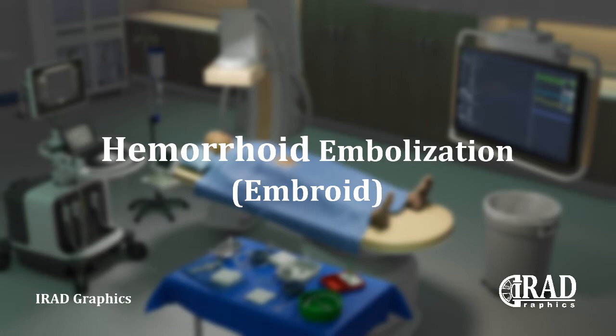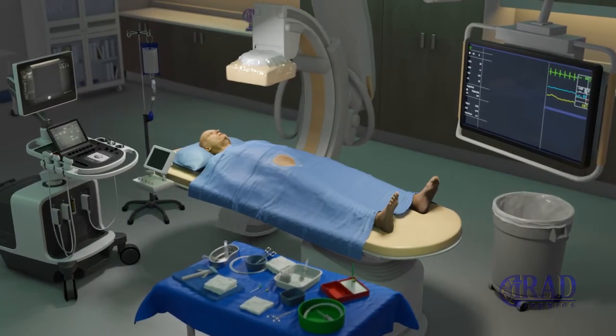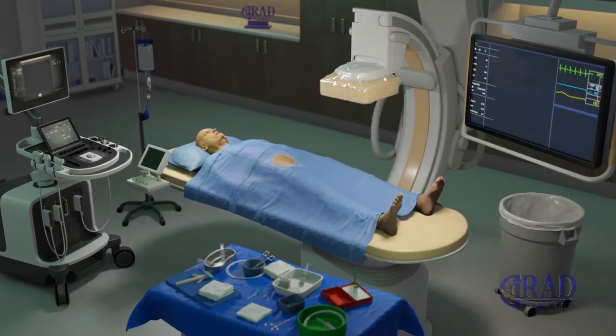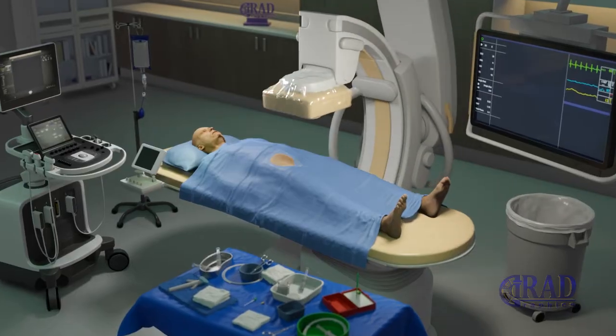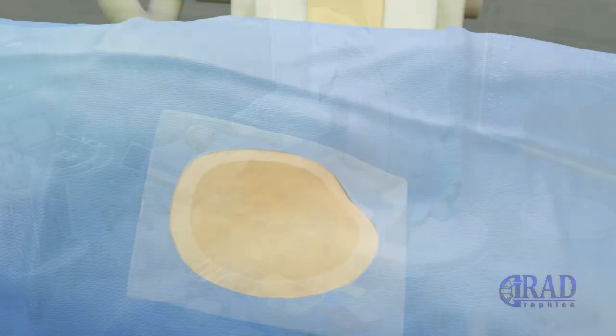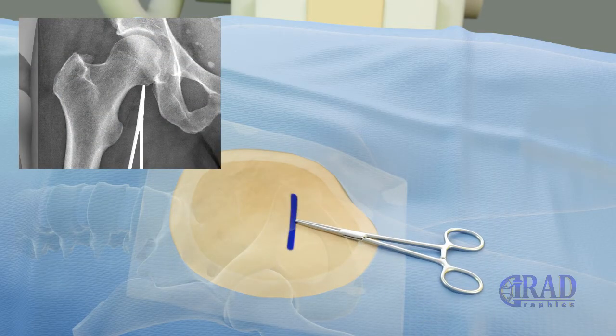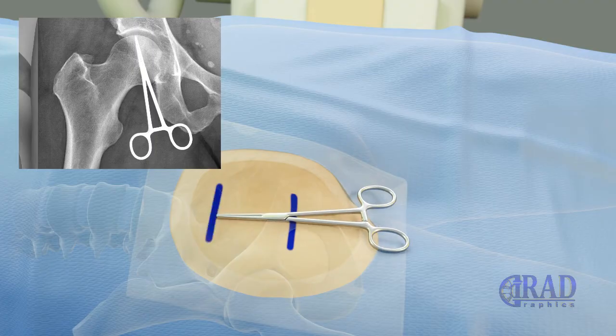Embolization of hemorrhoid is a recently introduced minimally invasive image-guided procedure for treatment of internal hemorrhoid in patients with symptomatic bleeds. This animation demonstrates how this minimally invasive procedure is performed step by step through the right groin access in angiogram suite.